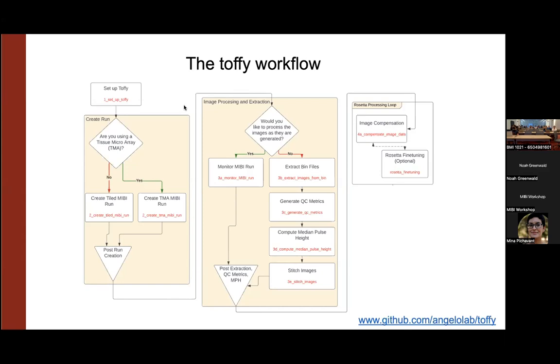After that, there's some post-processing steps. The first one is the Rosetta pipeline, which we're going to talk about today. If we go into more details, this is sort of our image subtraction, background correction, denoising approach. And the second is image normalization.